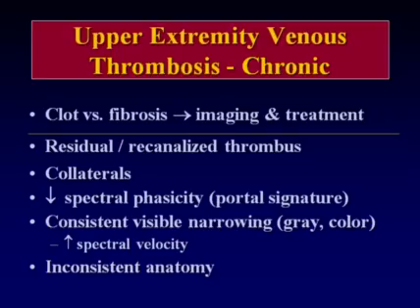Now, I mentioned that about 33% of patients with acute venous thrombosis will develop chronic venous disease, post-thrombotic syndrome. And this is another area where ultrasound may be used to clinical advantage.